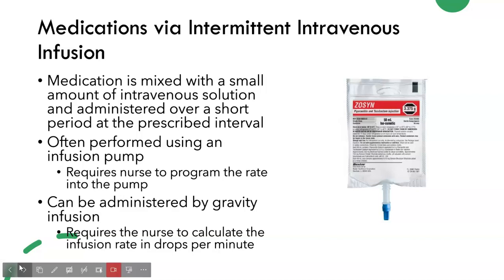So it's different than our IV push. It comes in a bag. So we've got 3.375 grams in 50 mils. So it's a small amount of IV solution.